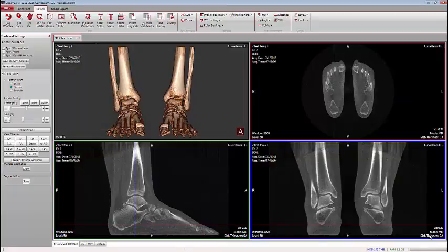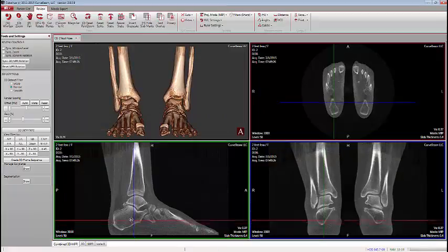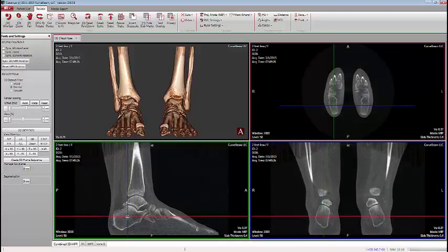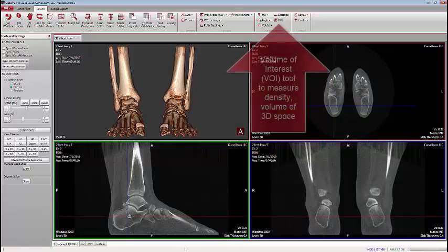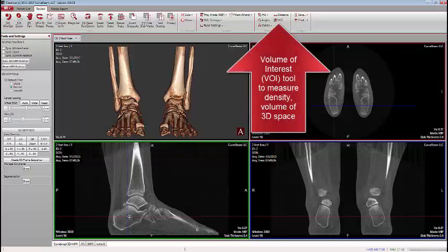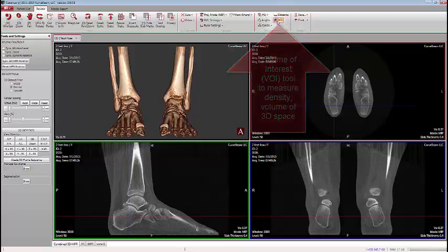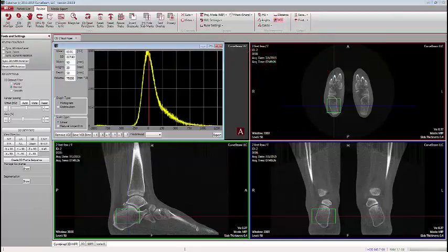Another tool that's been added is the Volume of Interest tool. First, place your crosshairs in roughly the area of anatomy you wish to measure the density of — in this case, the overall density of bone in the calcaneus. Previously, our HU measurement tools would only measure a somewhat thin slice. Now we can draw a cube that enables us to measure the volume of whatever is inside that cube.